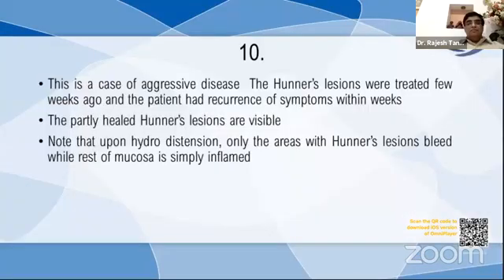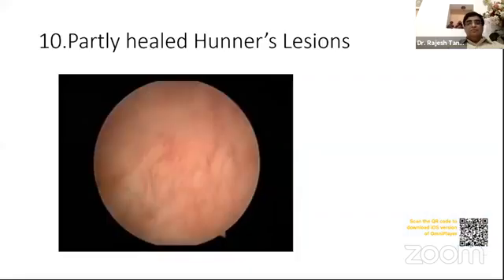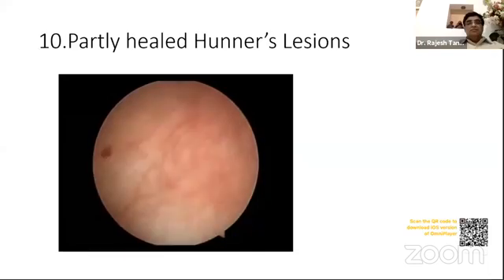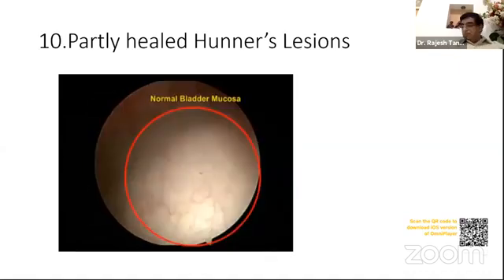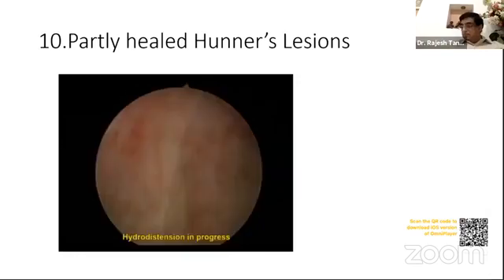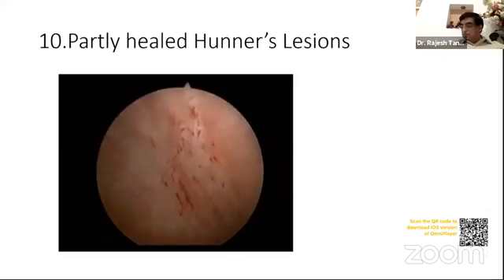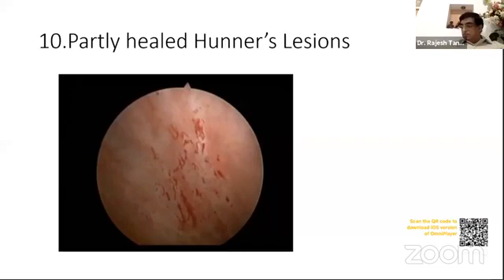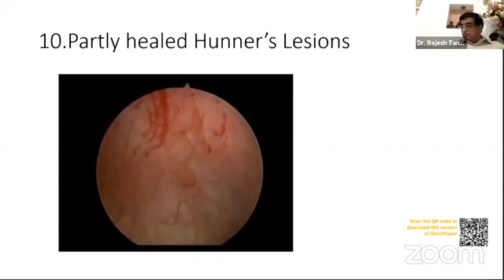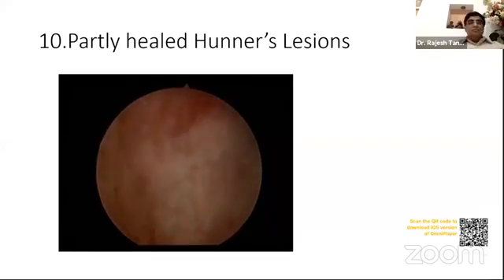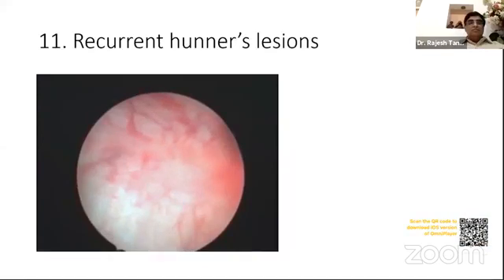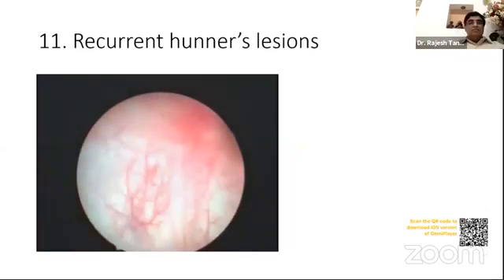This is a case of aggressive disease. The Hunner's lesions were treated a few weeks ago and the patient had recurrence of symptoms within weeks. The partly healed Hunner's lesions are visible. Note that upon hydrodistension, only the areas with Hunner's lesions bleed while the rest of the mucosa is simply inflated.